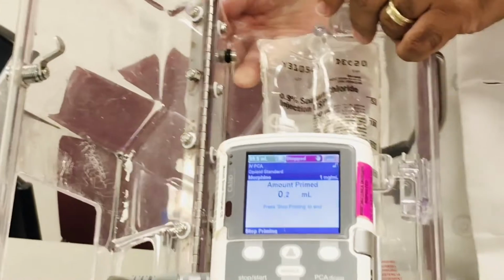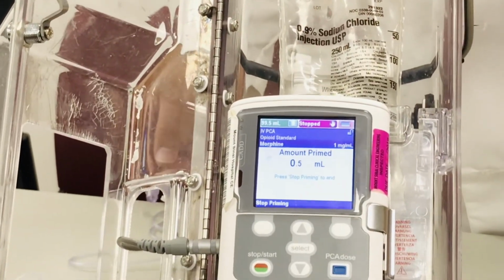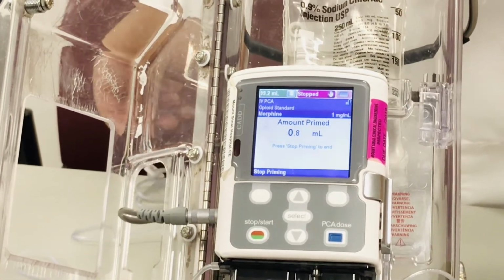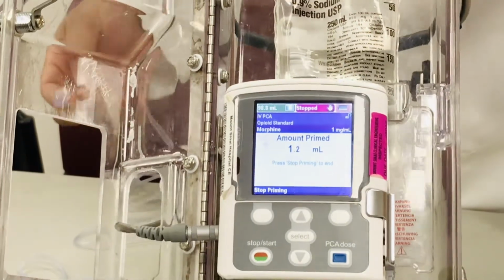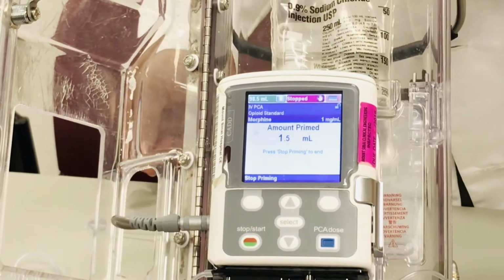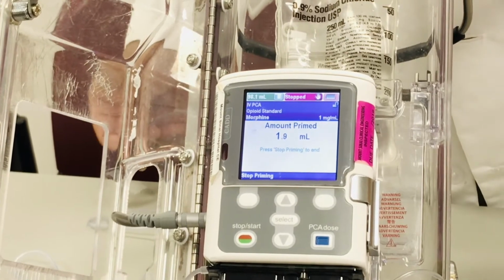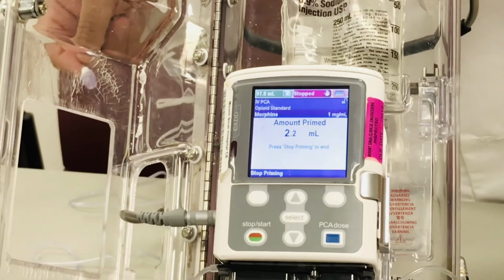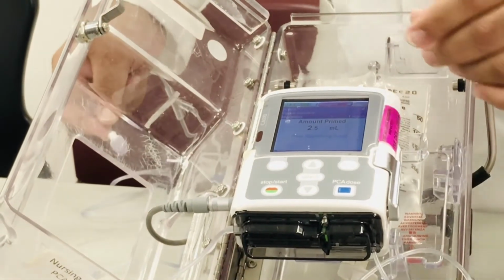The machine will automatically prime, and the most important goal is that when it primes, it's around 4 mLs, if I'm not mistaken. Let me just make sure. And what we're looking for is for a couple of drops of the medication to come out from the tubing.